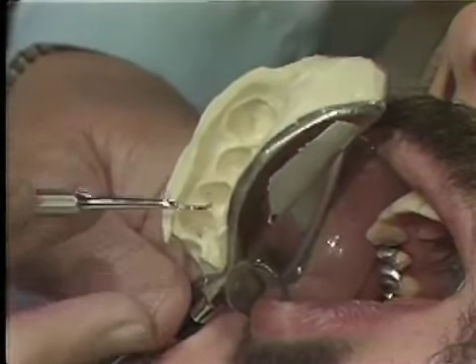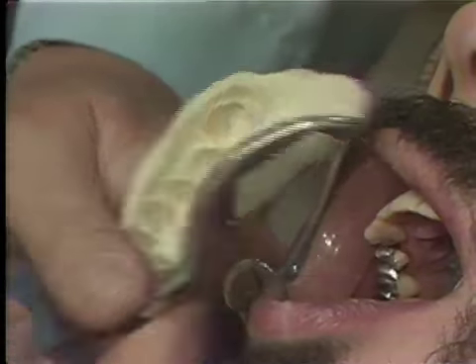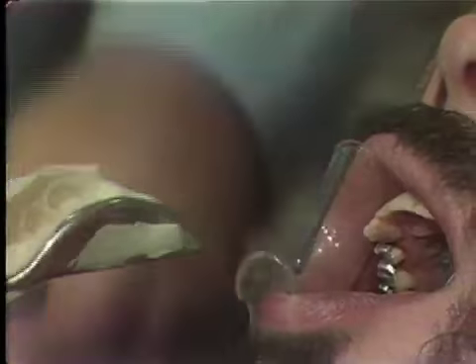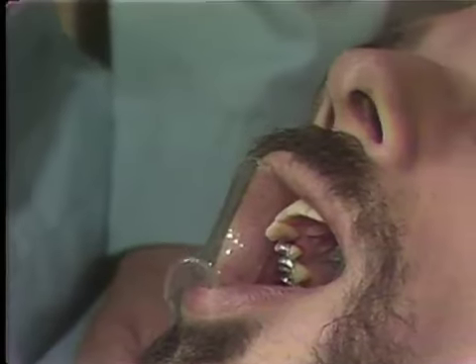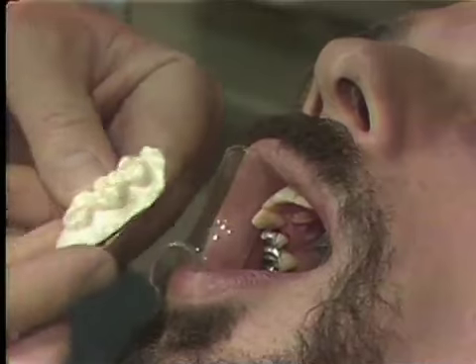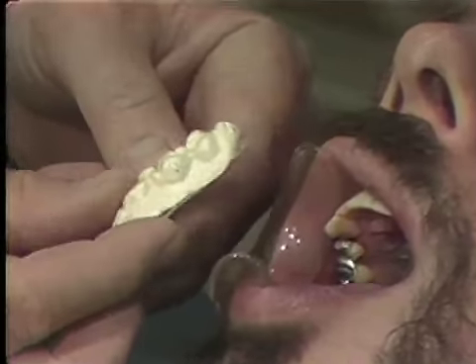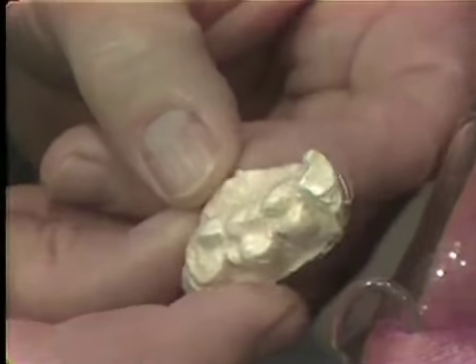Or you could fill the three tooth areas with Duralay and put the whole impression in the mouth to form the temporaries. The method that we'll use for this situation will be a thin shell that we've made on the Omnivac press. We took a little segmental impression off of any cast that you have of the patient's mouth.